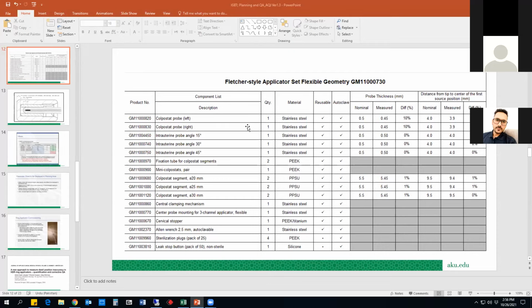In one practical example, we were measuring our transfer guide tubes, which were around 130.3 centimeter against 130 centimeter. So it was 3 millimeter higher. We referred this to the manufacturer, and then we got the answer, and we fixed this in-house. That is a different story. But there was an advice from the manufacturer that you should make this out of commission and use a new transfer guide tube. Although we were able to fix this issue, and now all our transfer guide tubes are 130 centimeter when we connect them with applicators. Is this the answer to your question?